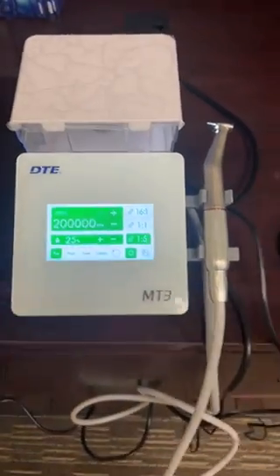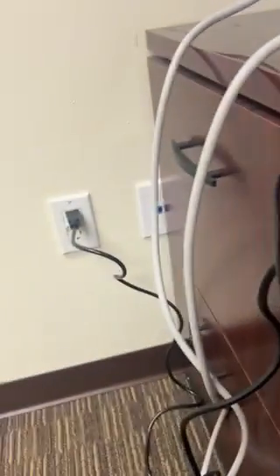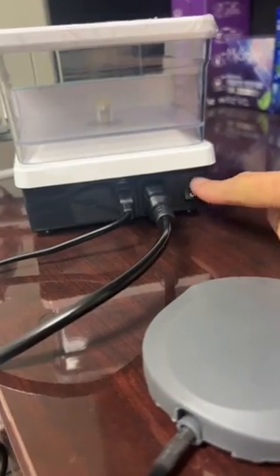As for setting it up, it's very, very easy. All you're going to do is plug in here for the power, and then right here is your foot pedal, and here's your on/off switch right here.